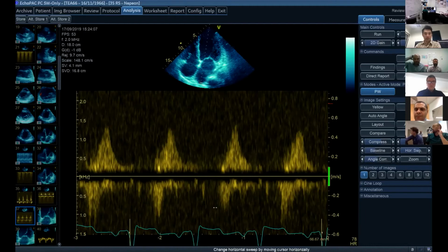So I agree, but I just want to know where that comes from. I think the big thing there is we don't have the systolic flow, which points towards significant mitral regurg. And for the sake of completeness, I should have reduced the sector width.